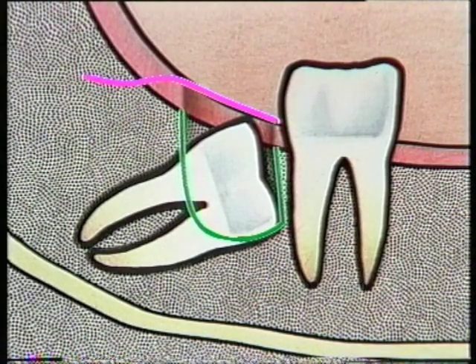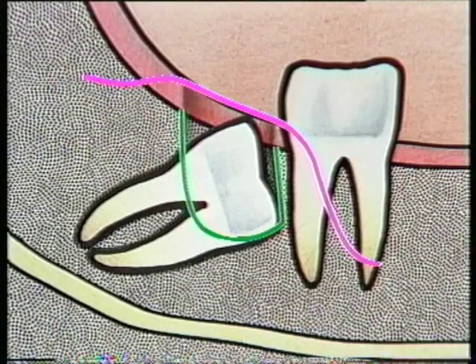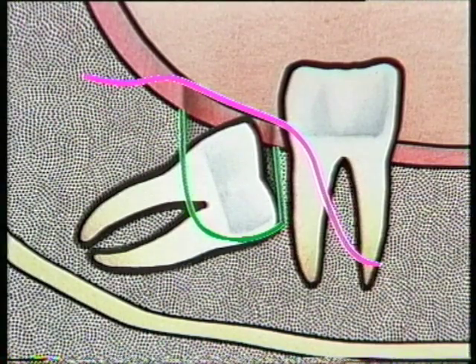The anterior part of the incision now moves forwards and downwards from the distal aspect of the second molar to run as a curving incision to end around the anterior part of the second molar's mesial root. With your plan of the surgical technique established, you are now ready to prepare to remove the third molar.